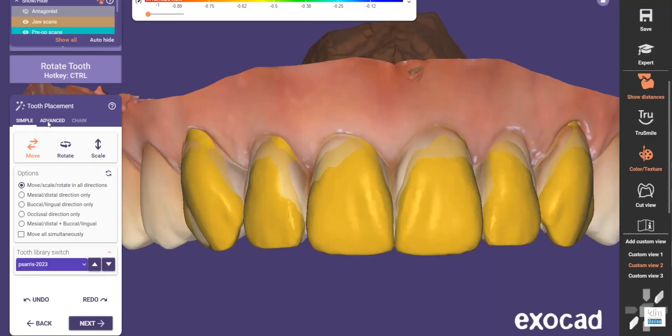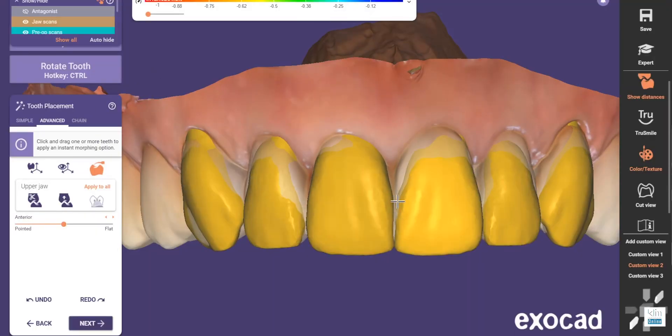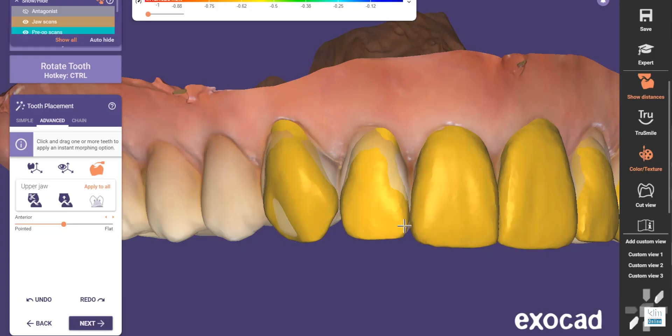I want to talk about how I entered into using ExoCAD — it was around the digital wax up, even though ExoCAD is a full software and I will post videos on how I use it. I still use CEREC, and sometimes I'll use ExoCAD even for restorative dentistry when I'm making transitional restorations — what we would call temporaries. This video is about the digital wax up.